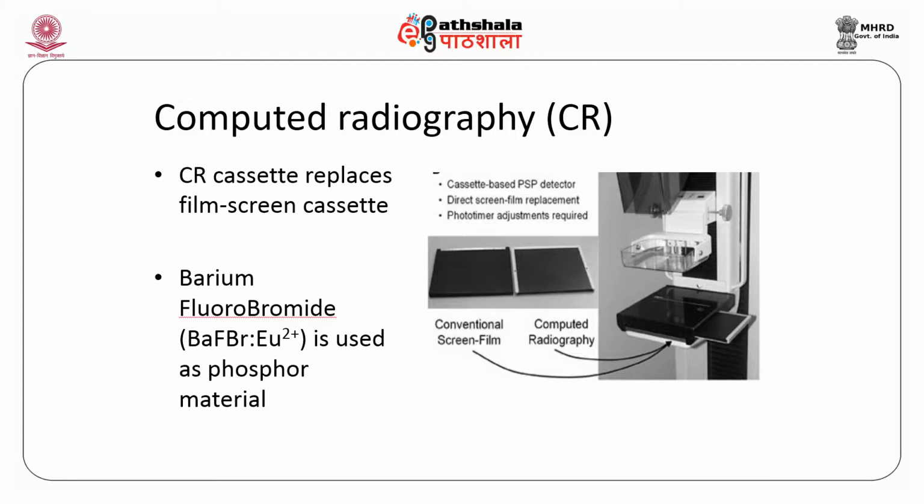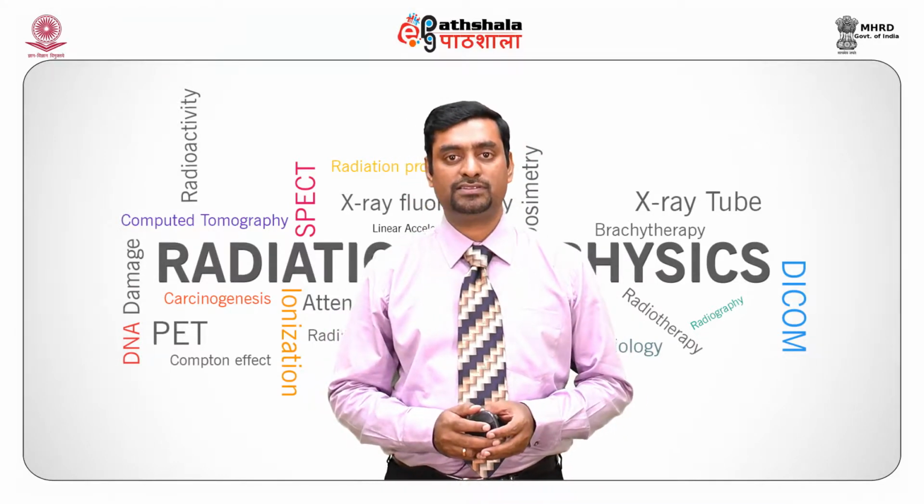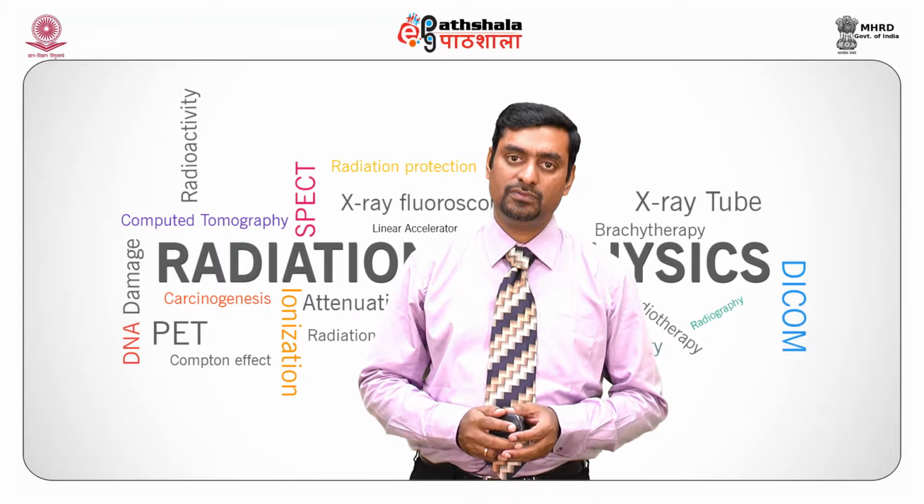Computed radiography uses a computed radiography cassette, which can replace the film screen cassette. It can also be used as a retrofit. The existing mammography systems, which were using film screen combination, can use the same cassettes from CR in the slot provided for the film screen mammography system. In a CR system, barium fluorobromide doped with europium 2+ is used as a phosphor material. The cassette based PSP detector directly replaces a direct screen film receptor.